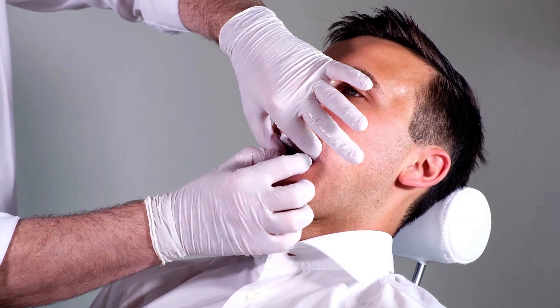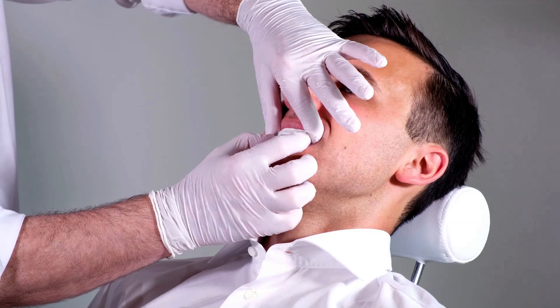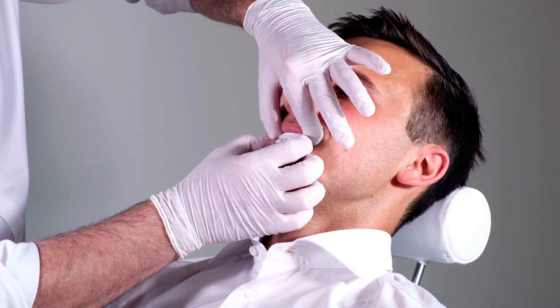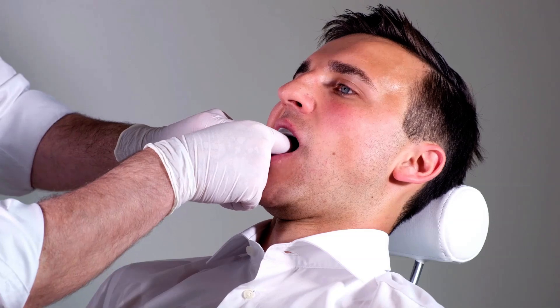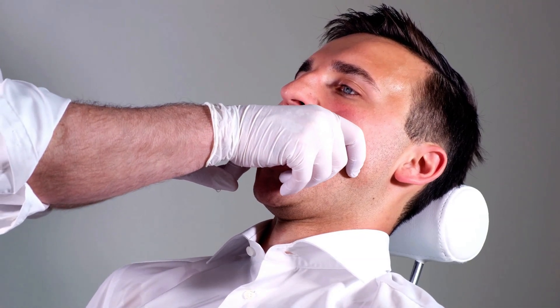With a forward lower jaw, let the patient firmly clench their teeth and keep them closed for about one and a half minutes. Meanwhile, let the patient open their mouth and check whether the outer and inner walls of the tray are close to the teeth. Correct if necessary.